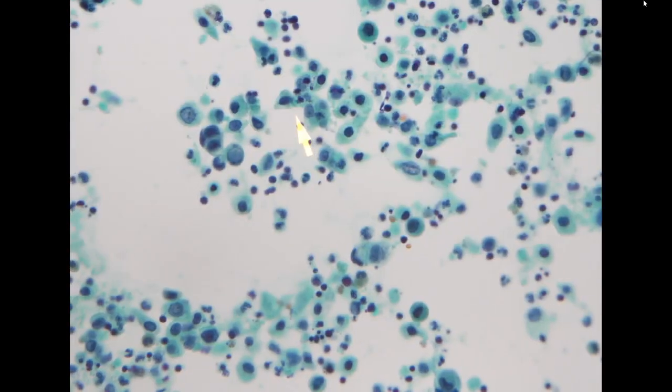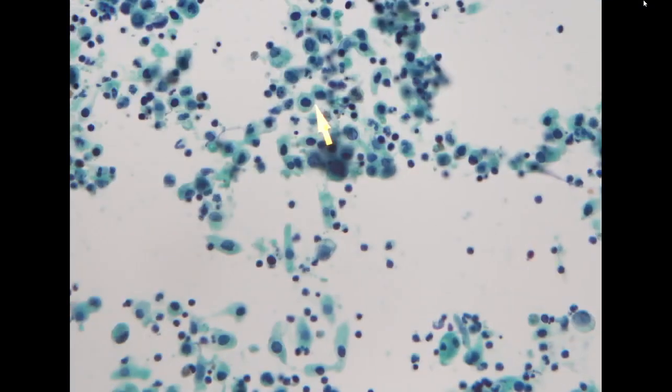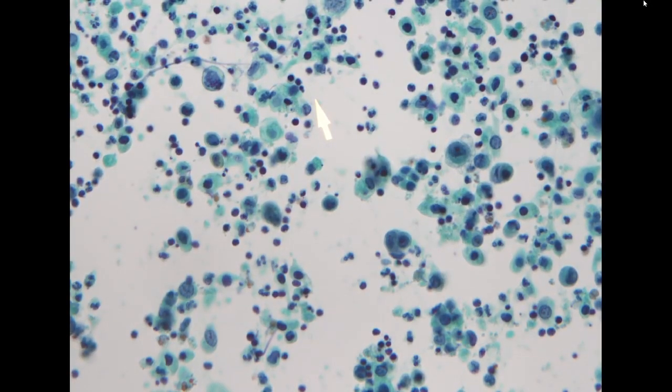Some look more like non-small cell, but in the background there are smaller cells, which also look atypical. So it's very difficult to judge whether it's small cell or non-small cell. In this situation, we just call it carcinoma. I think this is positive, but maybe the tumor has already gone through some transdifferentiation, and so the treatment is not working anymore.